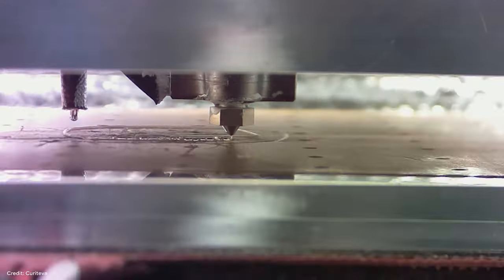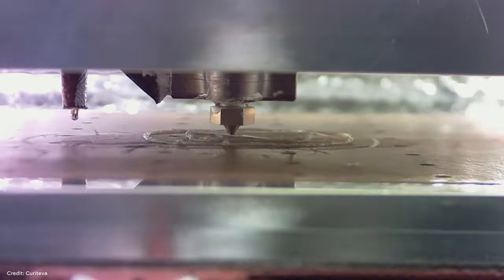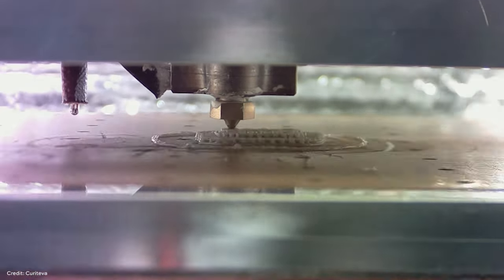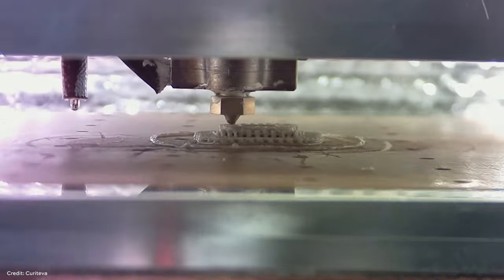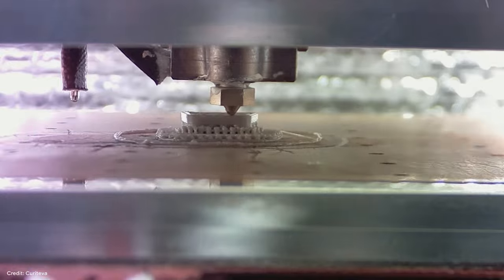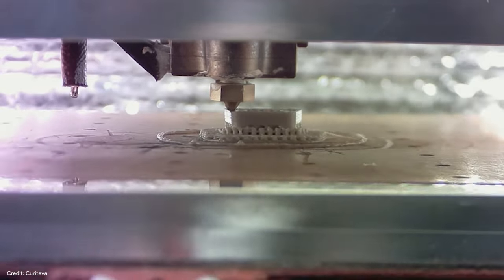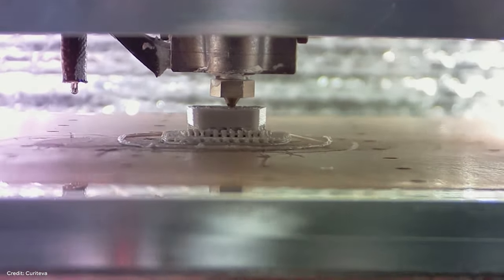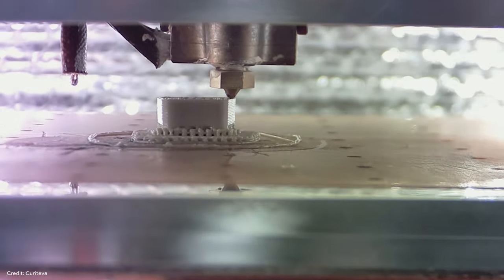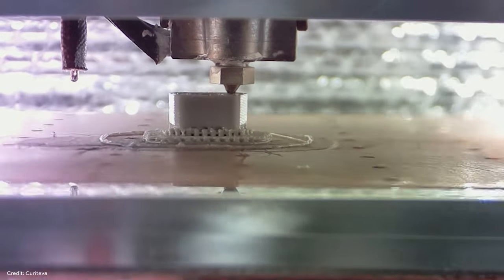The delta between the glass transition, Tg, and the melt temperature, Tm, is over 200 degrees Celsius. Tg is roughly around 140 degrees Celsius, and Tm is approximately 350 degrees Celsius. It's critical to manage the thermal history during the printing process to prevent locking the PEEK in an amorphous state versus a more desirable crystalline state. Our patented technology precisely targets the necessary heat at the active deposition layer during the extrusion.